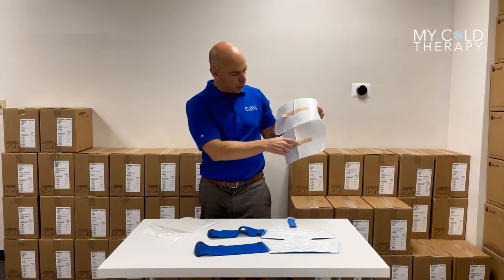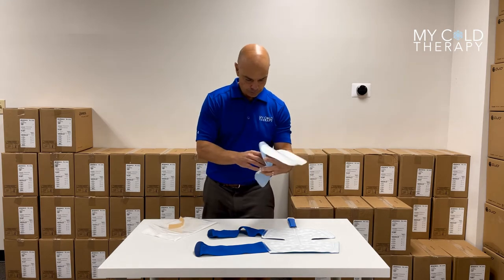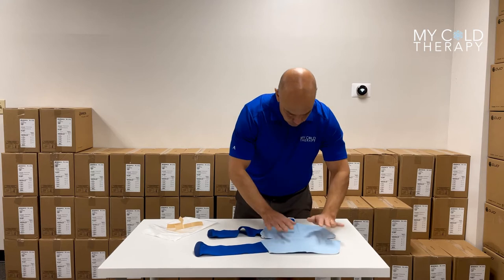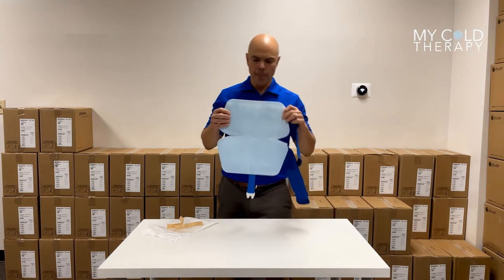It's going to come with two adhesive strips, so we peel those off, and then you put it directly on the back of the pad. The blue part is what's going to go on your skin. Once it's applied, you can put this directly on your skin.